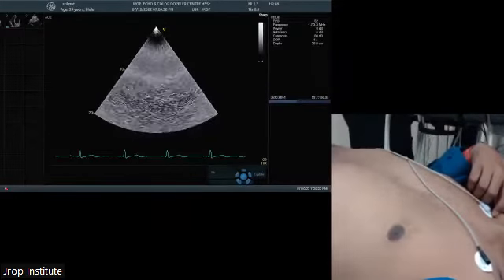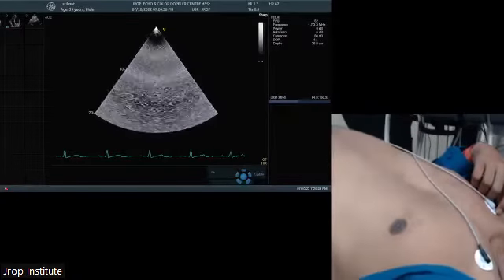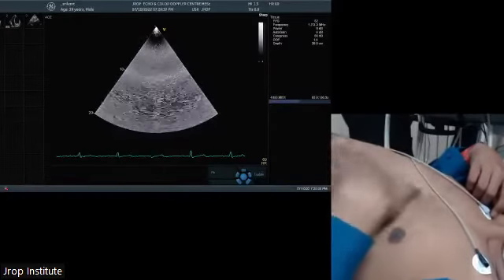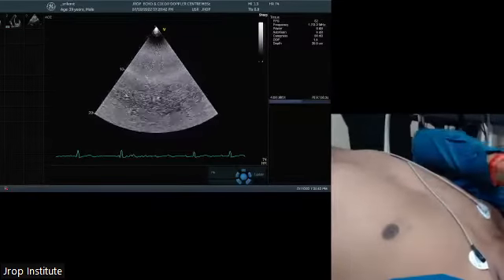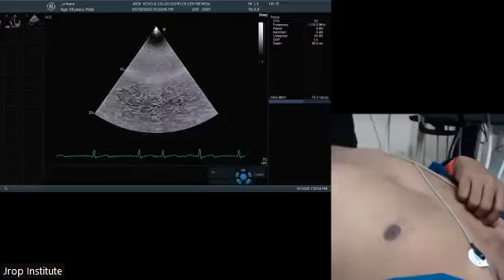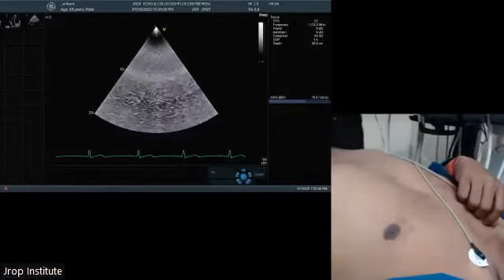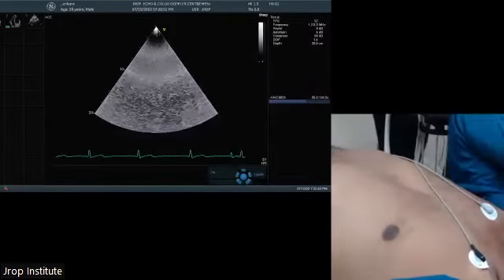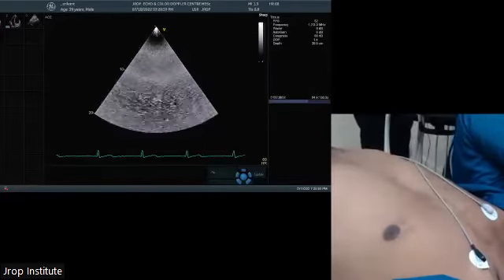Achal, you have some question? Yes, sir. My question was mainly related to measurements. Like the previous question, when we measure IVC, some people say that it should be measured where the hepatic vein just joins the IVC. Just distal to the hepatic vein. Correct. Closer to the heart, means closer to the RA. No, opposite side.